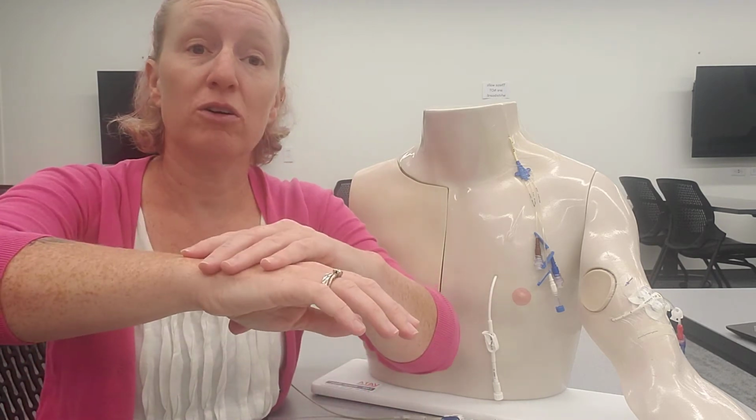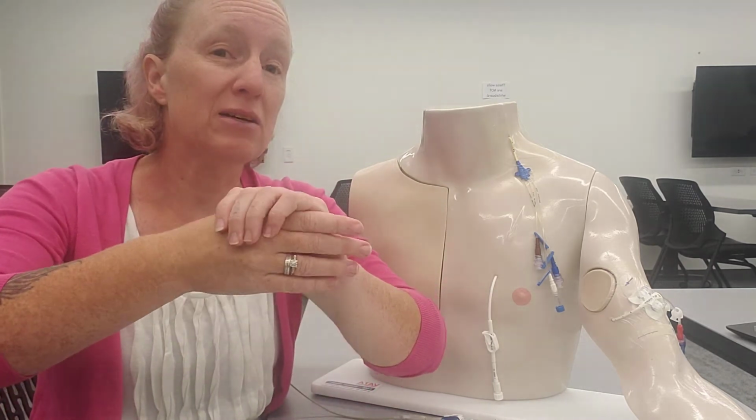There are peripheral lines, which are usually put in the arms. Sometimes you might see them in a foot. That's really rare. You might see them in little kiddos on their scalp. So IVs, intravenous, peripheral lines are probably our most common ones that we see, especially post-surgical and in labor and delivery, all that kind of stuff.